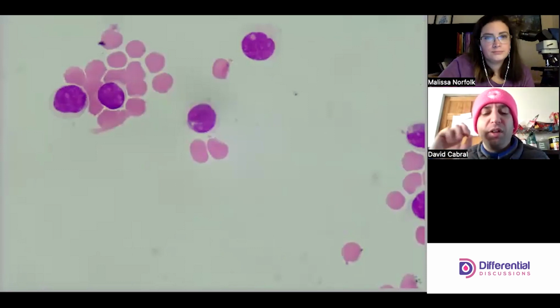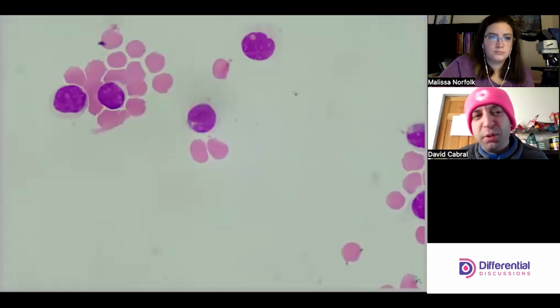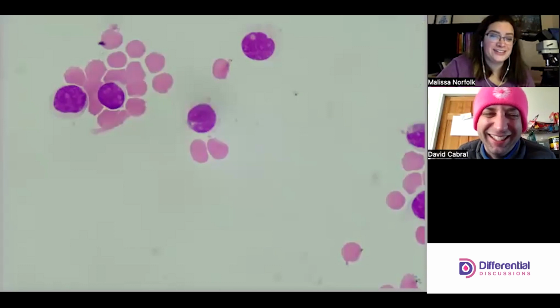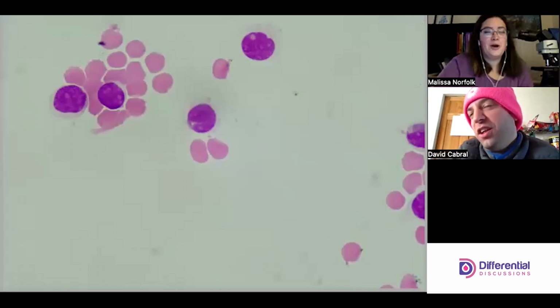When you're in a medical laboratory though, use the benefit of the experience that's around you. Always. Even Melissa and I are very experienced, and it's always good to get a second set of eyes to look at something, especially these borderline things. So try to think of differentials as a bit collaborative. Unfortunately for students, you must know these. But once you're out working in the field, it really is a 'Hey, can you look at this? I'm not sure.' Unless it's a competency or one of those fun things.